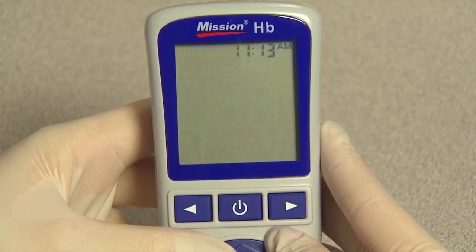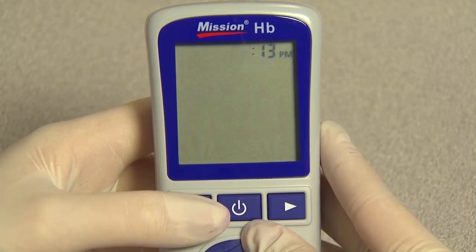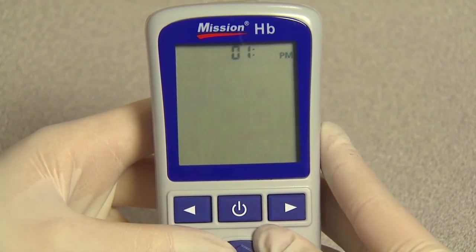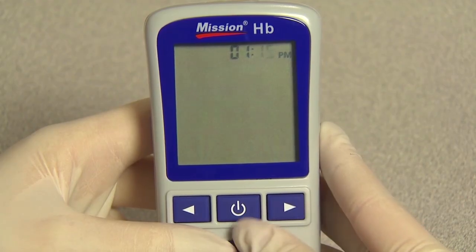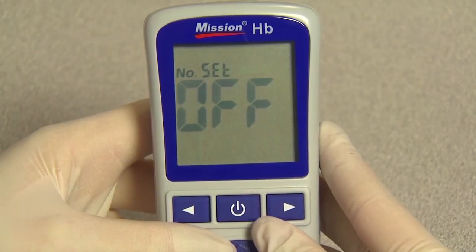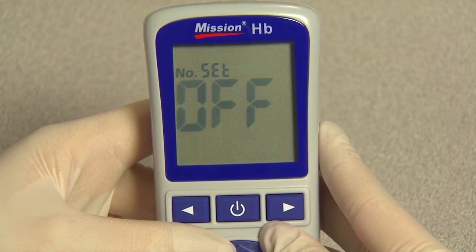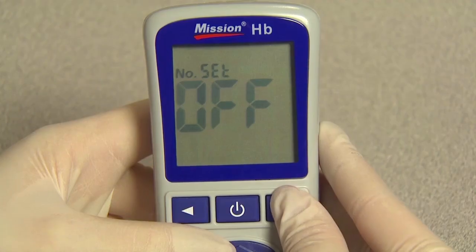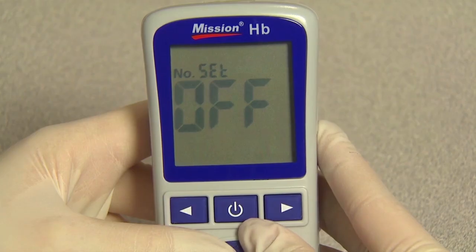Press right or left until the correct hour is displayed, then press the power button to save and proceed to minutes. The meter will display a.m. or p.m. if the 12-hour time setting is chosen. Minutes will flash. Press right or left until the correct minutes are displayed, then press the power button to save and proceed to test number reset setup. Press right or left to turn the test number reset on or off. The test number will reset to one for each new day of testing when the test number reset is turned on. Press the power button to save and proceed to units setup.